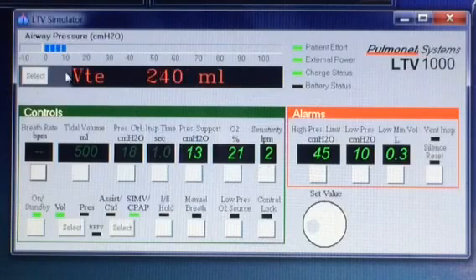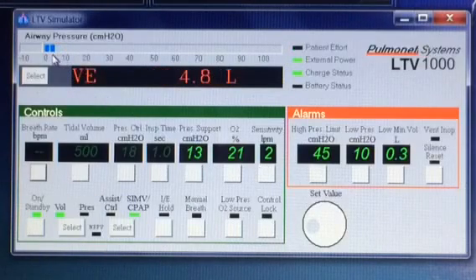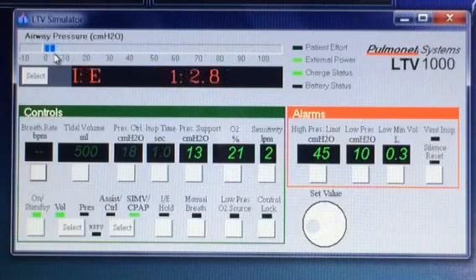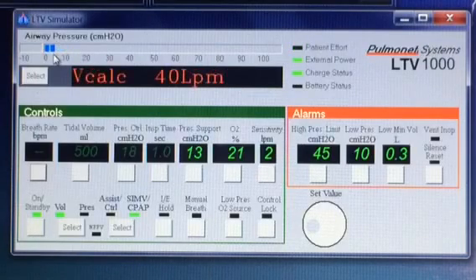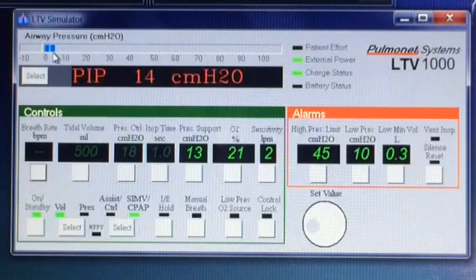We have the PEEP dialed in to 5. That means it's going to keep that pressure — it helps to keep their airways open and doesn't let them collapse. And that's the starting point of the breath.